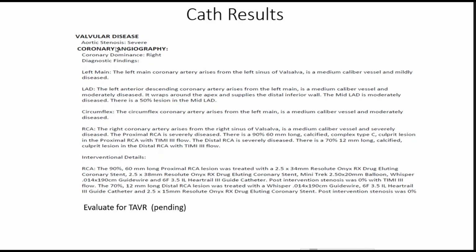They deemed the LAD to be moderate. However, they're going to reassess it when they bring the patient back for his TAVR after we went back and looked at the PET images. They'll reassess that, hopefully with IVUS, to determine whether or not intervention needs to be done.